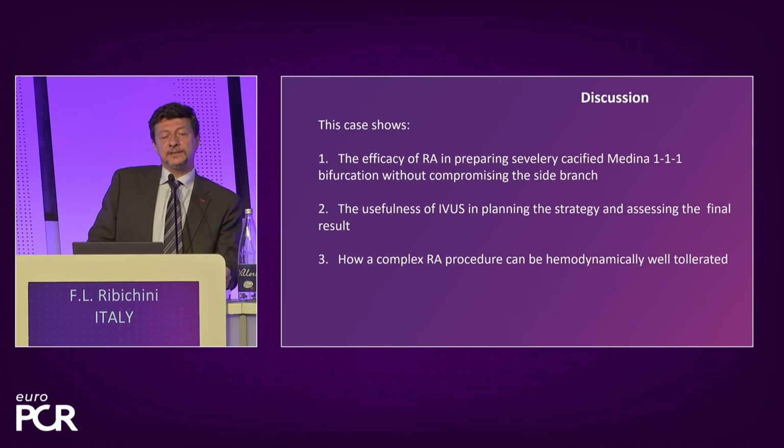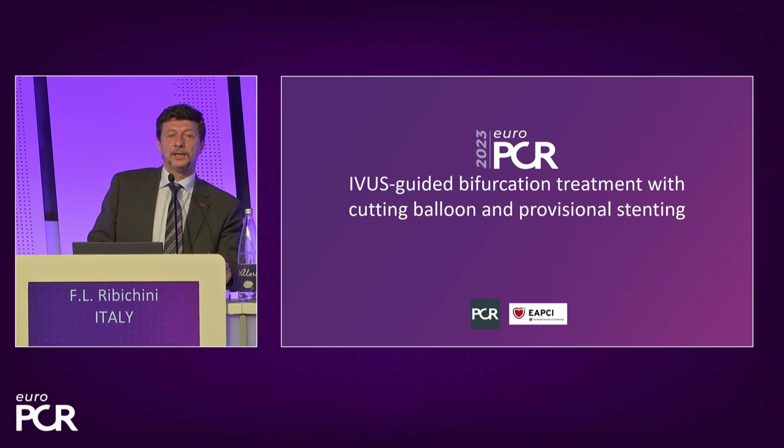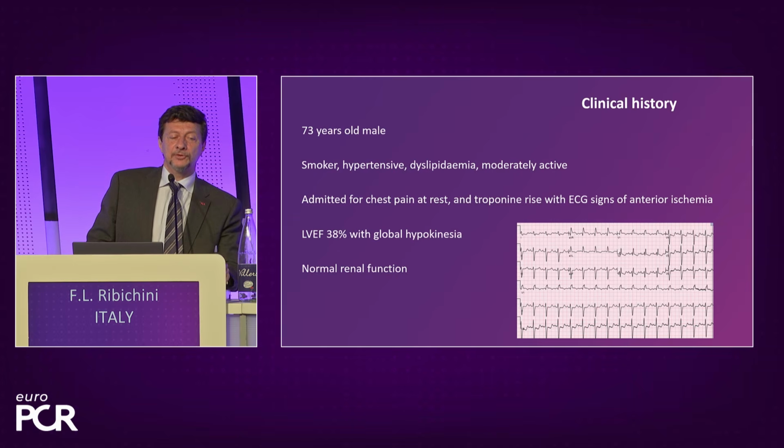The second case is, again, a case of a bifurcation with calcium, Medina 111, in which the IVUS was very useful in taking the decision, like in this first case. I want to underline that with normal LV function, in this complex case, we didn't have any kind of hemodynamic impairment, and the procedure was well tolerated. Again, IVUS, I like IVUS because in these old patients you don't give extra contrast. It's an almost contrast-less procedure.